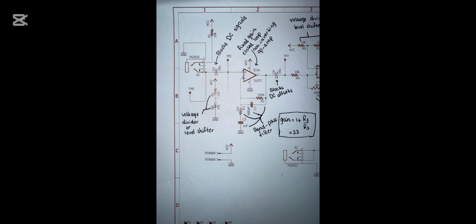First, the coupling capacitor C1 blocks DC voltage while allowing AC signals to pass through. Then the signal enters IC1A, which is part of IC TL072. This is a dual low-noise JFET op-amp. It's a fixed gain closed loop non-inverting amplifier. R6 and R5 form a voltage divider supplying the IC with 4.5 volts, and it allows the op-amp to work in a single supply mode. R2C2 and R3C3 form a bandpass filter.